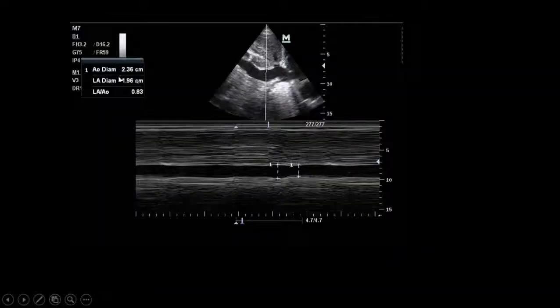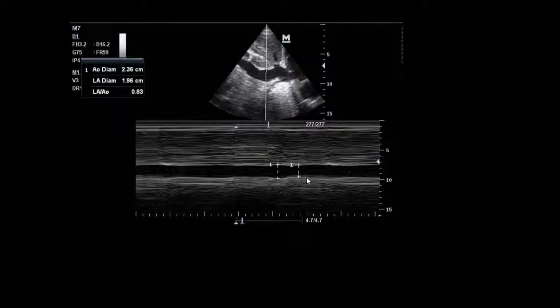The maximum IVC diameter is 2.36cm and minimum is 1.96cm. The IVC is full but distensible, which could suggest fluid responsiveness despite being full. To understand why it is full, we need to examine the heart.